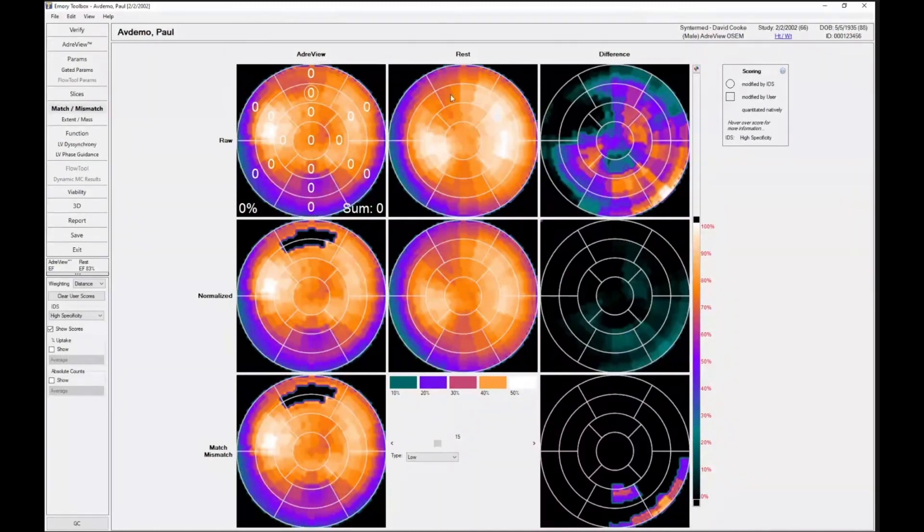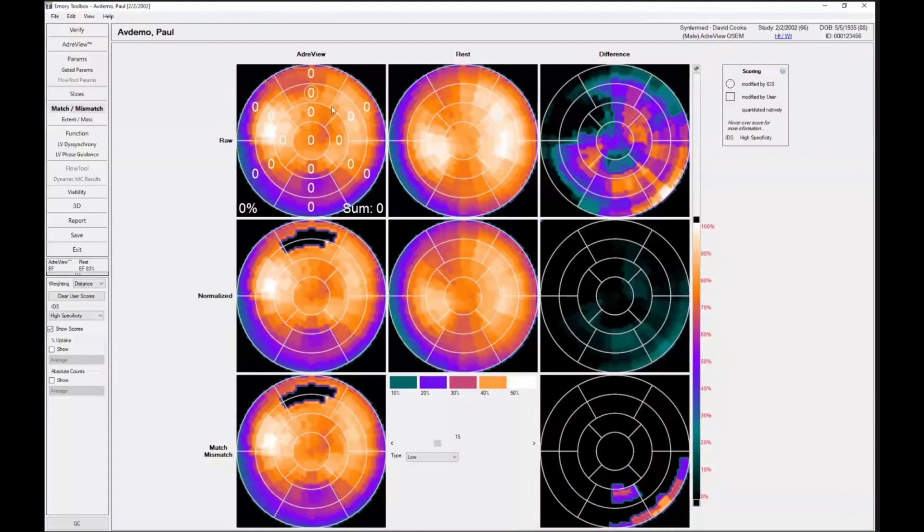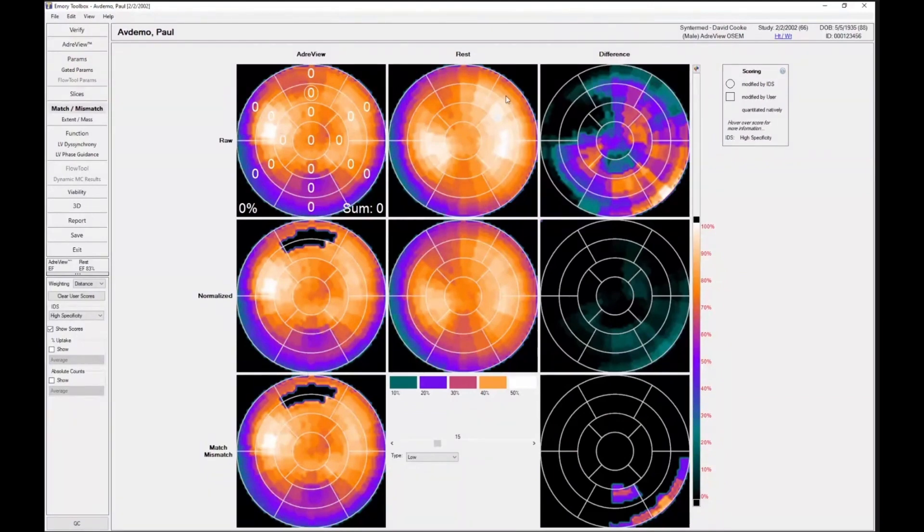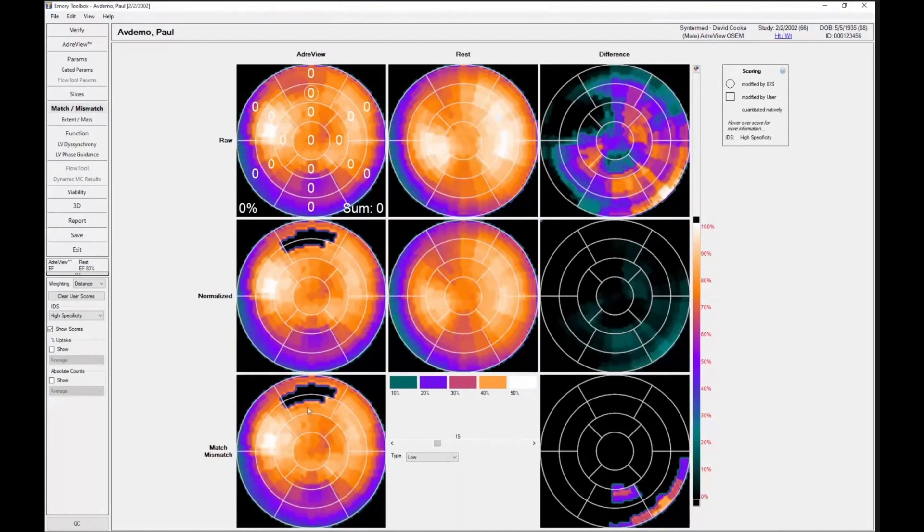For this particular patient, it's fairly normal. There's a small defect here in the anterior wall, and there wasn't enough uptake at rest in that area to pass the threshold, and that's why it still stays black.